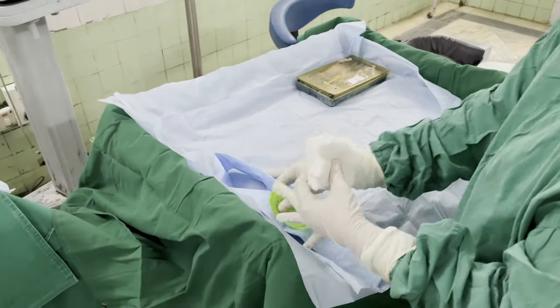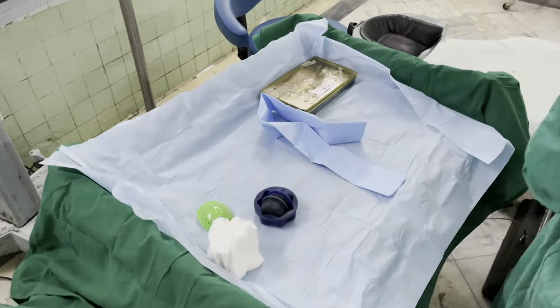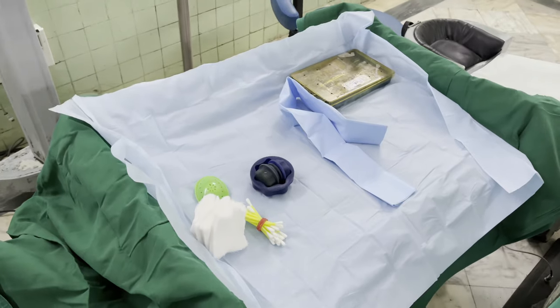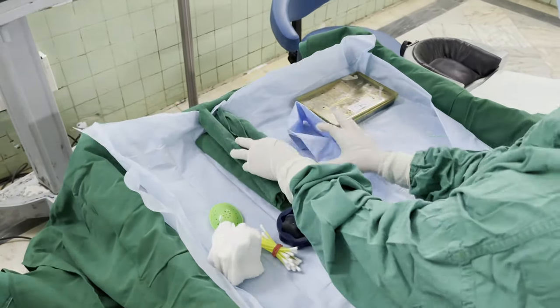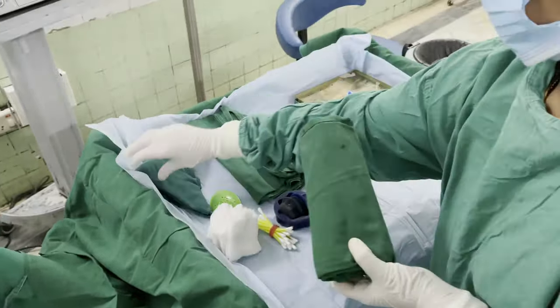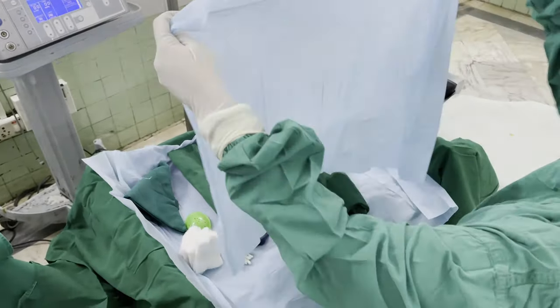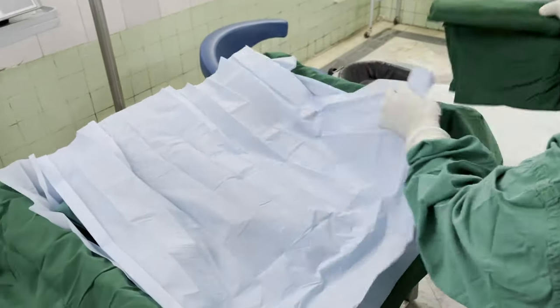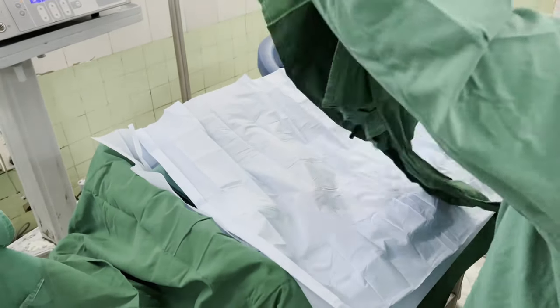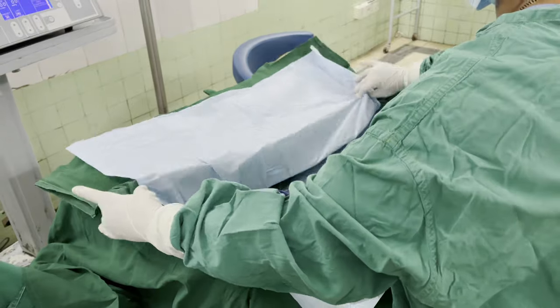That is the Phaco emulsification set being placed, and now the assembly of the rest. We place the eye patches, the shields which will go onto the eye later, cotton buds that are going to be used in assisting, the caps for the microscope which also need to be put up, and the plain green sheets which are used to cover the patient's head, to cover the eye, and to cover the entire body. The sheets that are being used now are the ones that are actually used to cover the trolley when not in use.